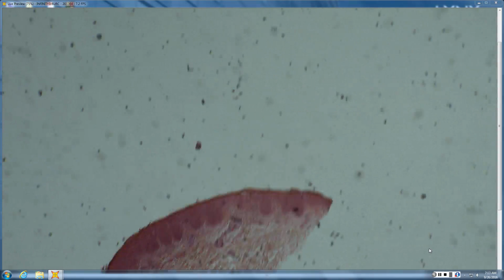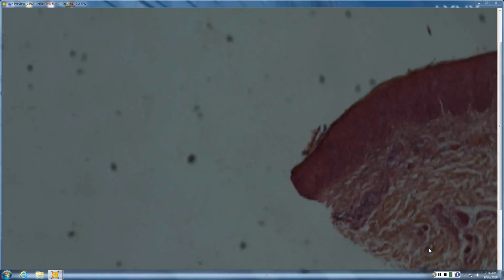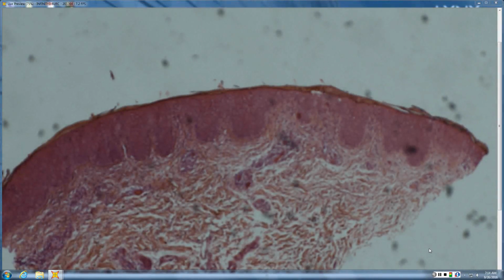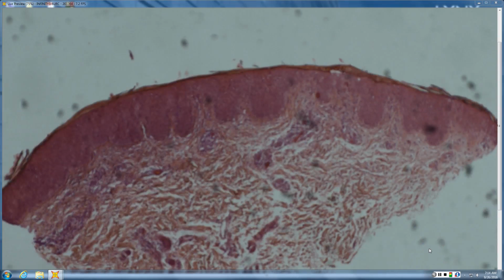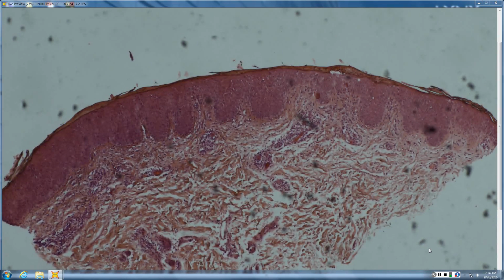Okay. So this one, I think, is just subacute spongiotic dermatitis. Let me check. So this is the dreaded subacute spongiotic dermatitis. This is the one, as I was alluding to before, that's always frustrating when you get this back as a biopsy report, because it really doesn't help you at all. Remember that many of us appreciate that, and we would rather not give you that diagnosis if we could. But the point of this slide is that sometimes that's all you get, and that's all you can say. And it's completely impossible to try to say anything else more specific that might be going on.